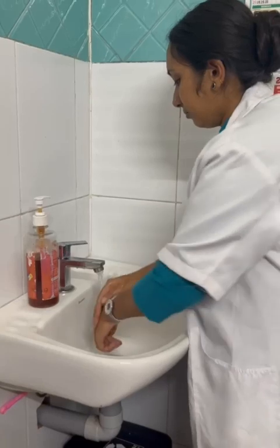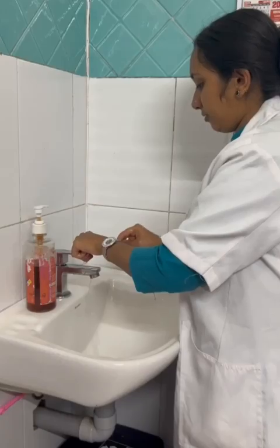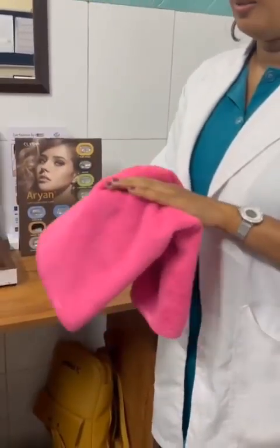Our first step is hand washing. It's a mandatory step — no one should avoid this step while dealing with contact lens. After this, we should dry our hands with a tissue paper or a lint-free towel.